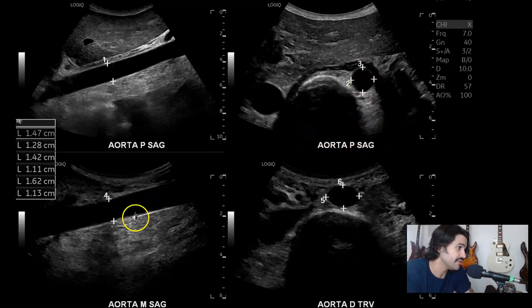This is sagittal, then transverse. Mid-sagittal and mid-transverse. Here's the aorta, this is the vertebrae, this is the IVC, here you can see the liver. Some people like to measure the AP in transverse. I do it in both because it should be the same. If you're off to the sides of the vessel, you might undermeasure, but you know there's an aneurysm — you're not going to mismeasure a potential aneurysm just because you're slightly off.